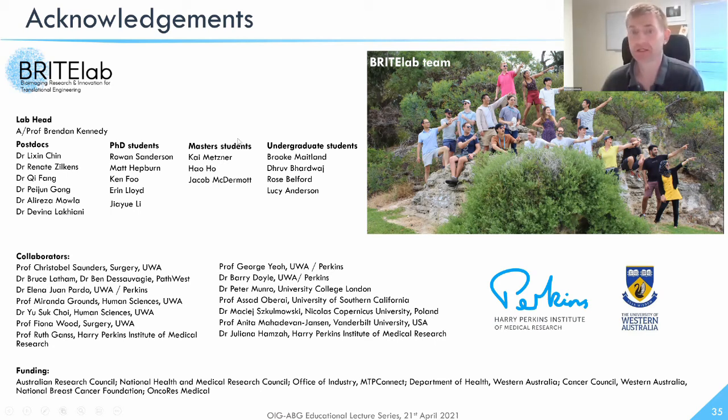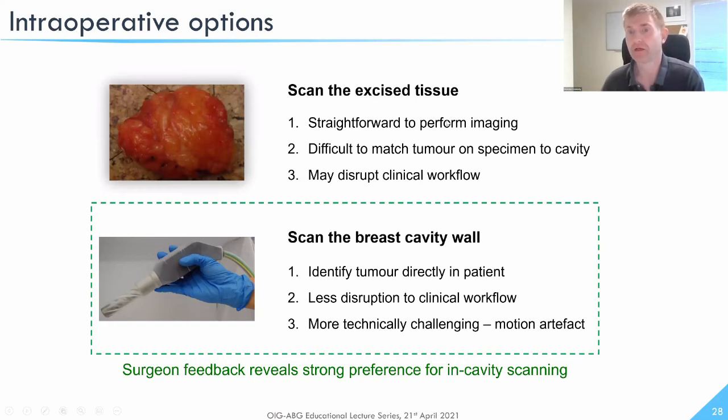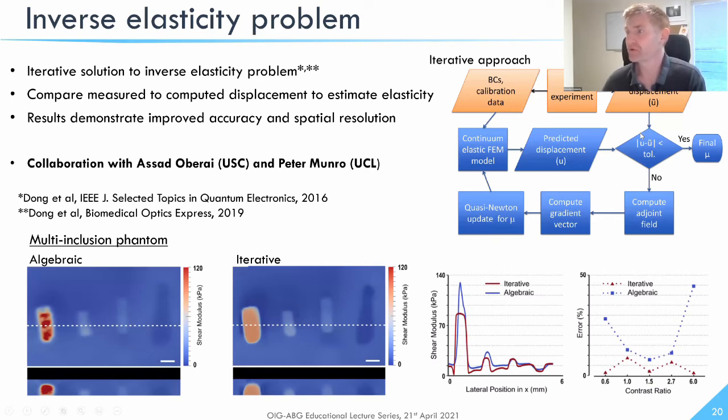Thank you, Steve. Yeah, that's a good question. And the answer is it very well could. If we go back to the slide, what you rely on is that the inverse problem is well posed. In other words, that there's one unique solution to it. So in our nice easy cases here where we've got silicone phantoms, that's probably the case. But in complex breast tissue, it may not be.